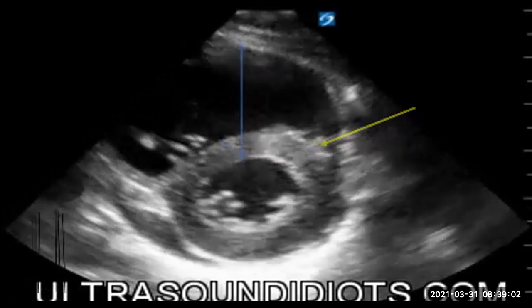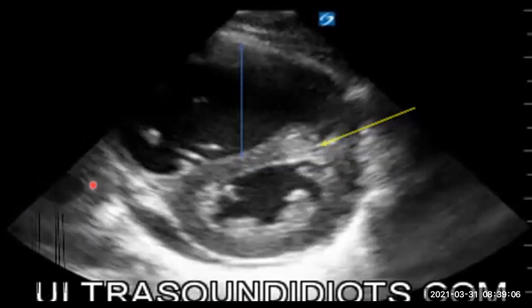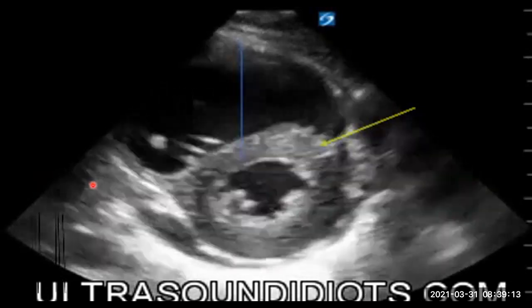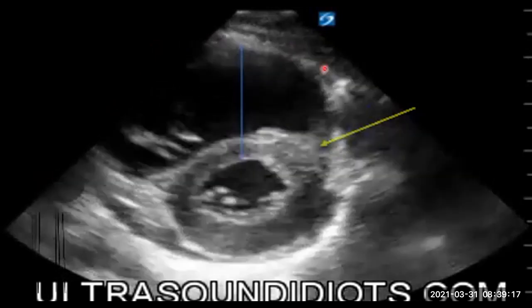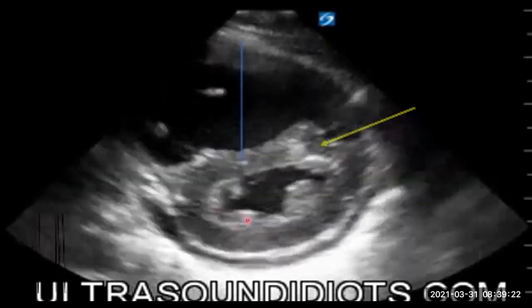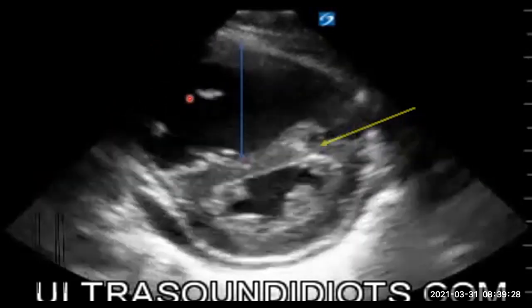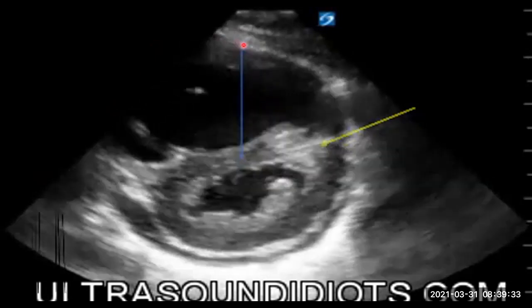All right. So this is something I haven't taught you guys yet, which is the parasternal short axis. Instead of looking at the heart from this direction, we're now cutting it in that direction, which we'll get to. But I just wanted to illustrate the difference. So in the parasternal short, this is the right ventricle, and this is the left ventricle. It's just to show you the same thing from a different point of view. The left ventricle we can always notice because of its muscularity. But you see the same thing. You see this highly dilated right ventricle, extremely dilated actually, with a wall that's not moving.